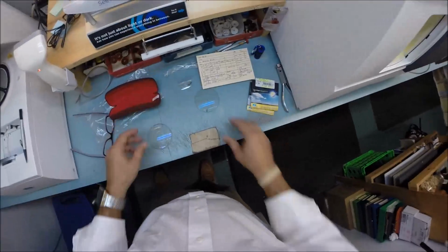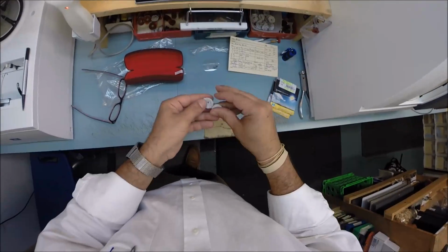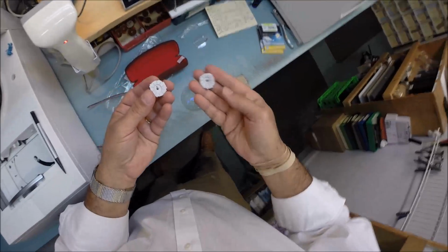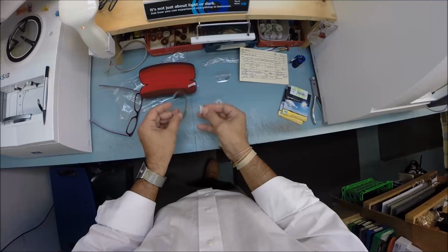Okay, where am I? Oh yeah, right lens. Okay, so put that there. As you know, your brother has gotten a pair from me. Your mom has gotten like 2 pair from me. So you know what this is. It is a block. I need to attach this to your lens.